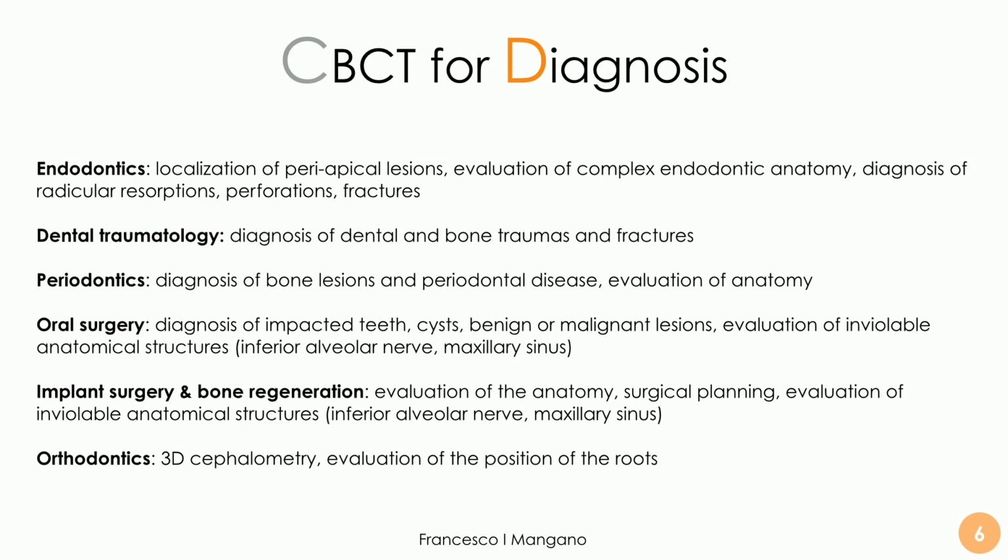And we have to consider that for many years, all the dentists have made their diagnosis based on the clinical evidence and the 2D radiology. But now we have cone beam computed tomography. We have this tool that is changing and revolutionizing the world of dentistry. In fact, it's spreading all around the world, and now we can find this machine in almost all the dental offices, for the digital dentists in particular.